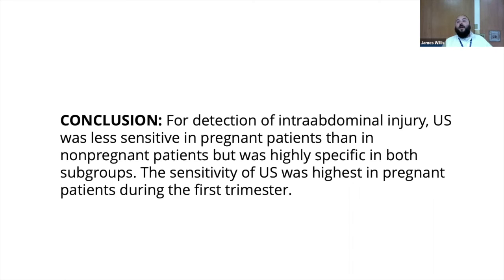I would assume that it's in the first trimester mostly because you can actually get a better view of the pelvic region, the pelvic images in early trimester as opposed to when the fetus and uterus is large.